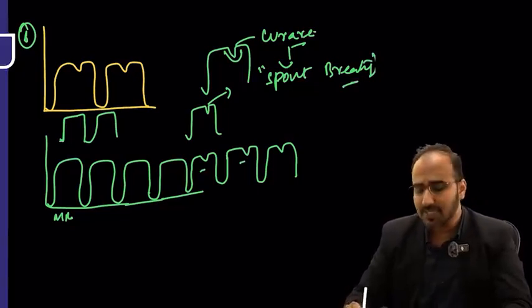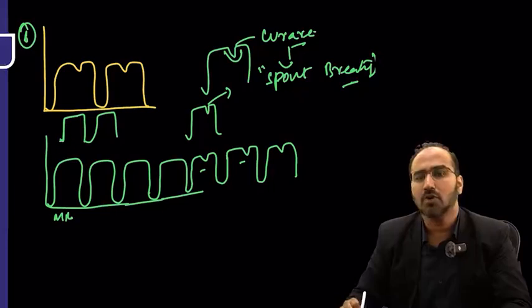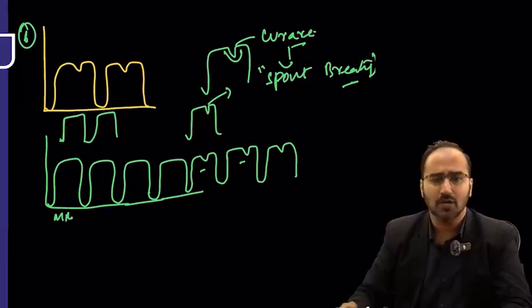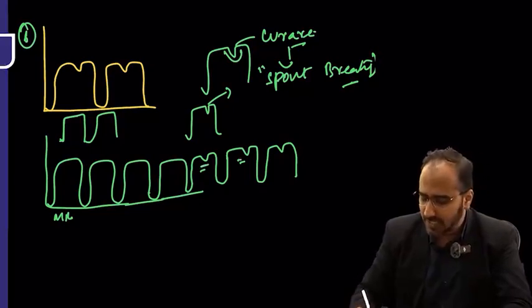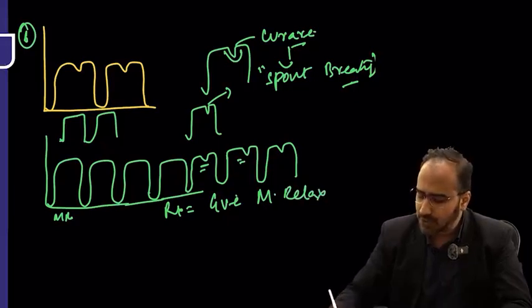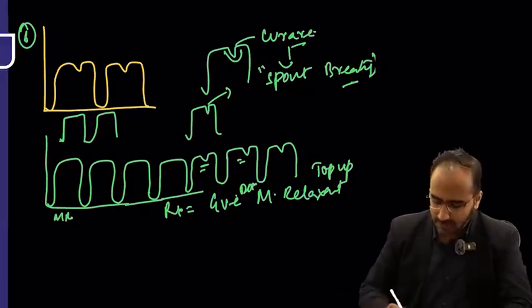What will you do guys if you see this kind of Curare notch? You will first ask the surgeon how much more time the surgery will take. The surgeon will tell you 1.5 more hours. So what we need to do guys? Will you continue the surgery in this manner? No. When you see this Curare notch, the next step that you need to do is give a muscle relaxant. You need to give the top-up dose of muscle relaxant. Okay? That's regarding capnography.